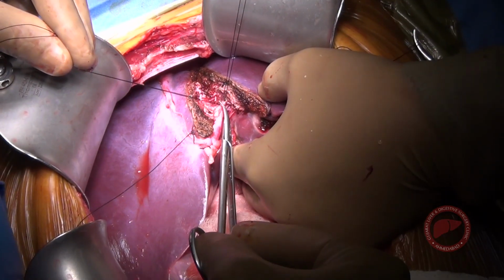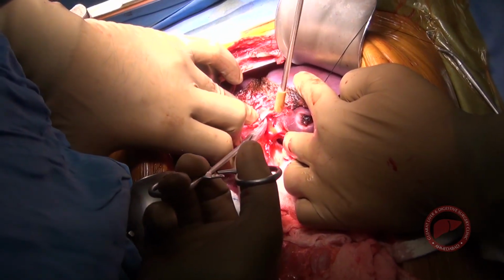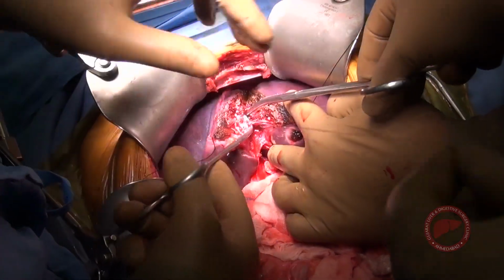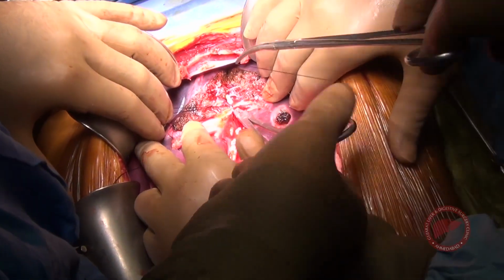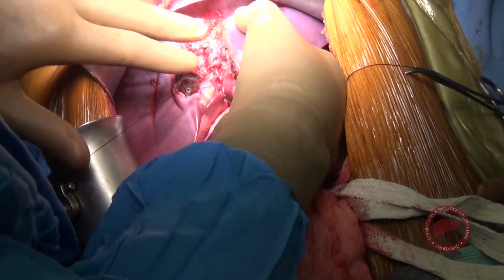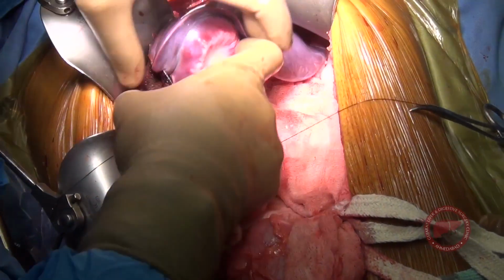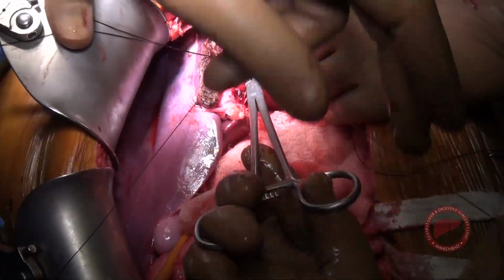Larger pedicles were ligated and divided. Parenchymal transection progresses further after dividing all the pedicles.